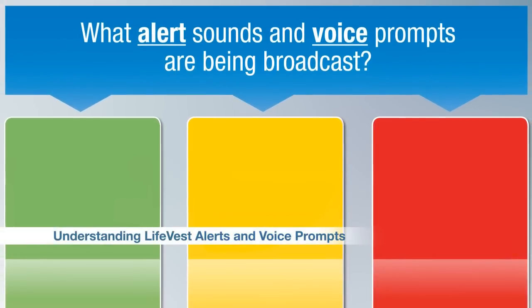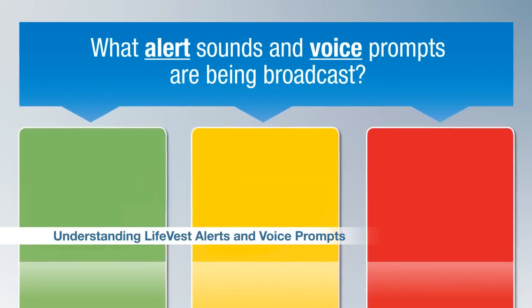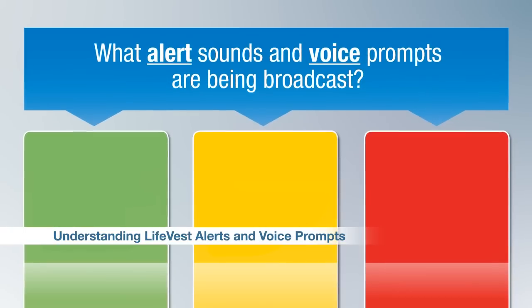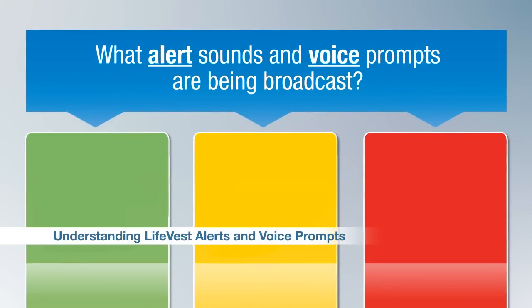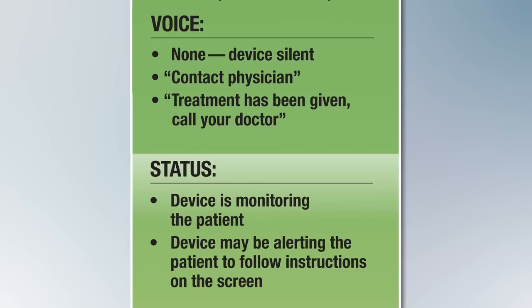In order to quickly and effectively care for a patient wearing the LifeVest, it is important to understand the different alerts and voice prompts that may be broadcast from the device. If the LifeVest device is silent when you arrive on the scene, the device may be monitoring the patient's heart rhythm. If, however, you arrive on the scene and you hear a single-tone alert, or a gong from the LifeVest, the device may be alerting the patient to follow instructions displayed on the monitor screen. In some instances, the gong alert may also be accompanied by a voice prompt.